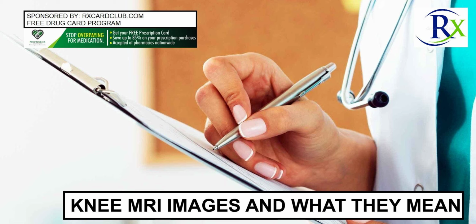Although knee fractures and dislocations are often diagnosed with an X-ray, an MRI can help your healthcare provider determine whether you have any soft tissue damage associated with your injury, such as a tear in a nearby ligament or cartilage. An MRI can be used to help your healthcare provider diagnose problems with your knee, such as an injury to the meniscus, a ligament, or a tendon.